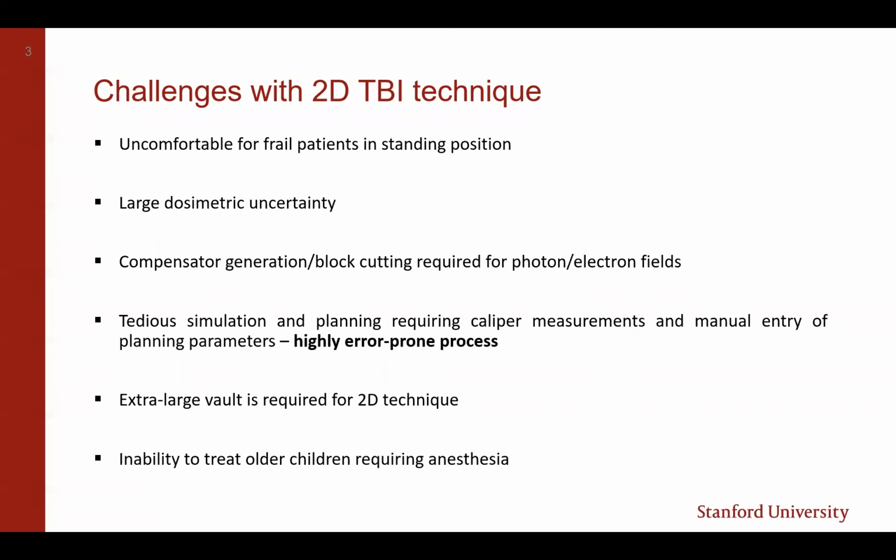So there are several challenges with this technique. Mainly, even for healthy patients, this can be a pretty uncomfortable technique to undergo because it requires you to stand for long periods of time. And it's that much harder for patients who are actually undergoing treatment for these diseases. They're really frail, and it requires them to stand continuously for 20-some odd minutes, if not longer.